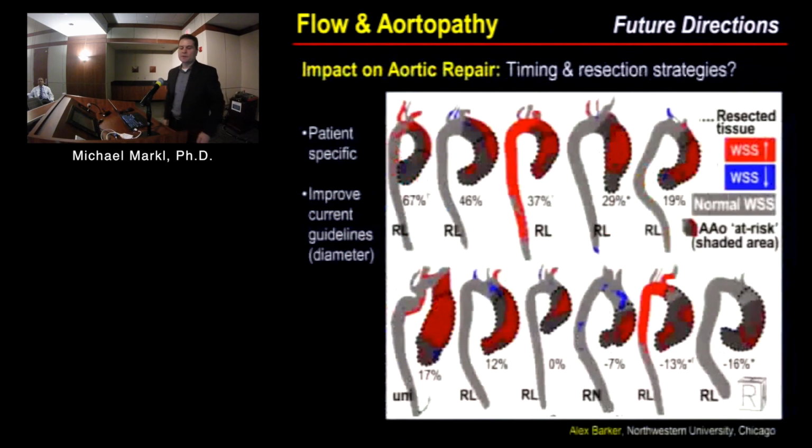And secondly, what we thought was interesting, and this is more the cardiac surgery approach here, is can we maybe use these maps for better individualized risk stratification or surgical guidance? Currently, surgery is indicated merely based on diameter. If it's 5.5 centimeters or above, or if the growth rate is more like half a centimeter per year, then typically that's intervened. But if you think about the disease, there's this heterogeneous expression of aortopathy, and then there's also these very different shear stress maps.